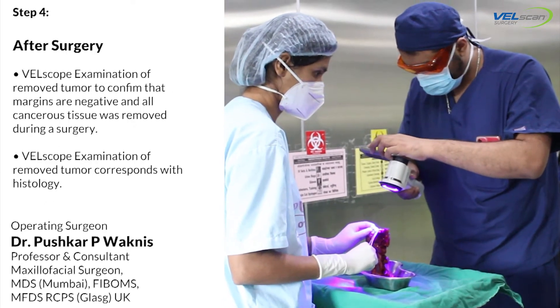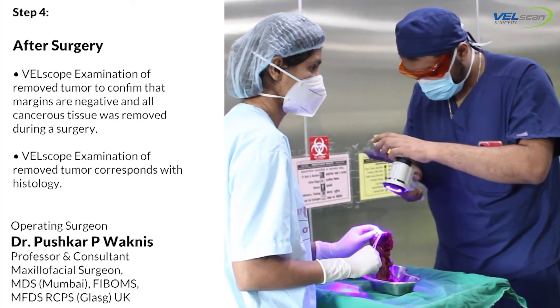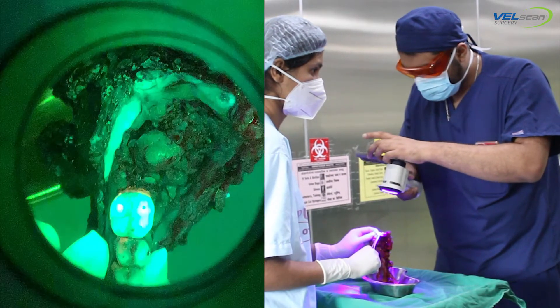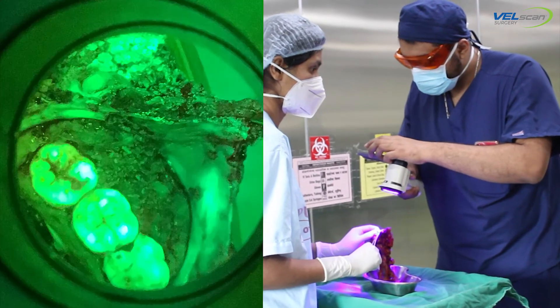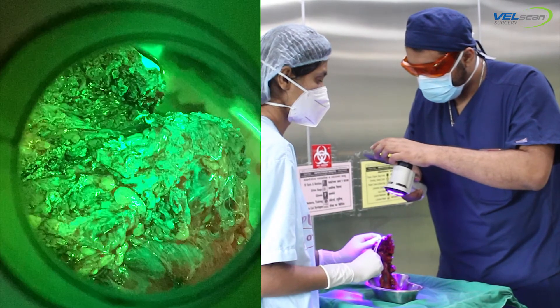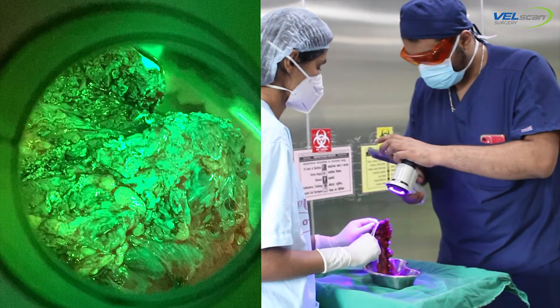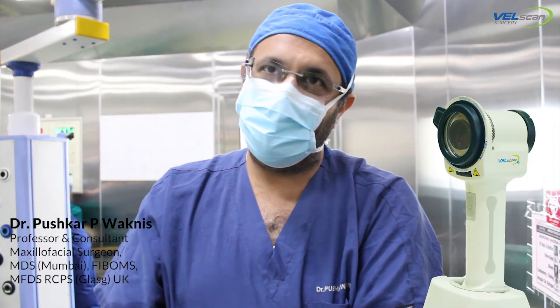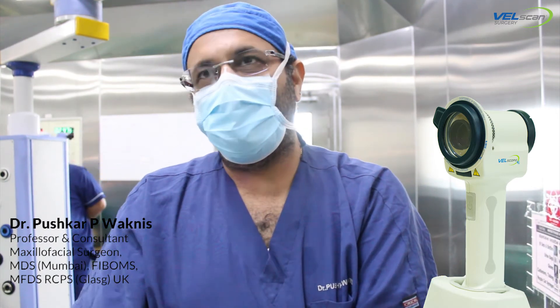With the VELscan, we have a machine by which I can see the specimen and immediately see the fluorescence or the loss of fluorescence in the area of the tumour, and see how the margins look to confirm that the margins are clear. This corresponds to the report of the frozen section. In oral cancer, not everybody has access to big institutes and frozen section setups, so the VELscan can be a good option to confirm during surgery that the margins are clear.